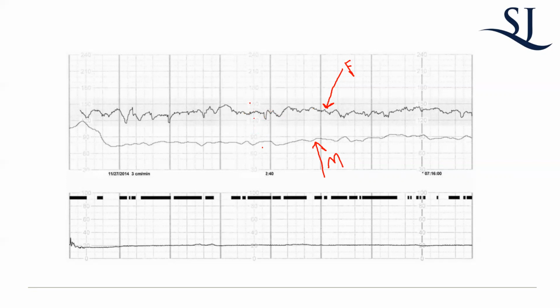This is a little light on here, but these numbers here correspond to the beats per minute, okay? And then what you'll see is usually there are annotations, usually the nurse will do this. There'll be time points. This person, for example, was checked. Sometimes they'll say ruptured membranes, 3 centimeters, blah, blah, blah. Don't worry too much about that because there's a lot of variability between the actual programs. But the essential parts are fetus, mom, and these are beats per minute. Down here, and this is separated by a gap because it's a different measurement. This is what? Do people know?